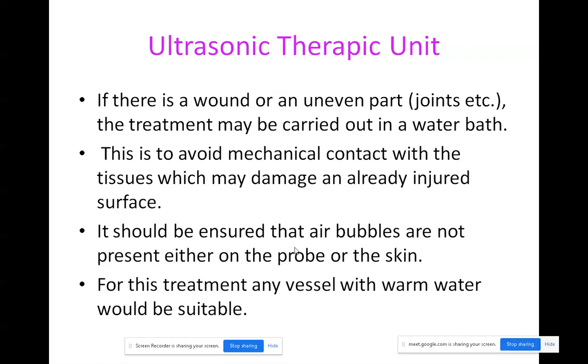The first small part will be very similar to each other, all the areas will be the same, but in between the wrist and the shoulder you will be having the elbow. So in the elbow you will be having hard bones. So the movement of your probe will not be the same throughout your hand. That is the uneven part.